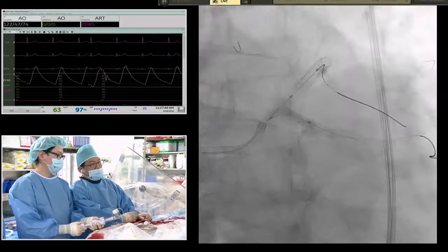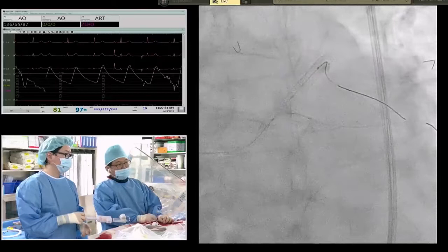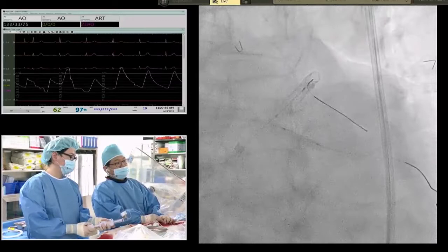20, 24, 28, 28. Yes, you can see the well expanded stent. Good. Can you see? Yeah, that's okay. It looks definitely well expanded. Yeah, and I'd like to insert more. 10, 12, 14, deflation.